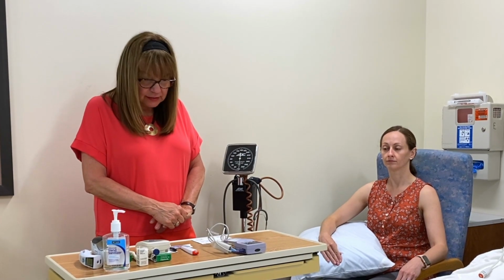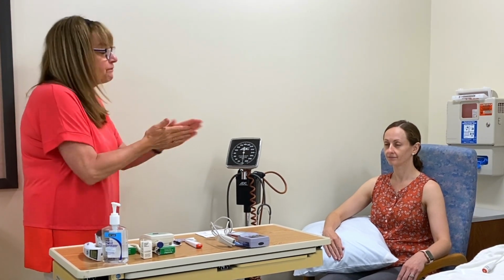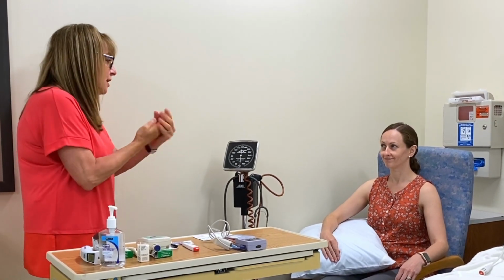Okay, so I'm going to get started this morning. I have my patient here, Monique. Again, remember, anytime that you access a patient, you're going to wash your hands, state your name, identify the patient, explain the procedure, provide privacy, etc.